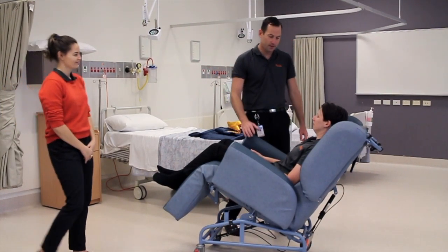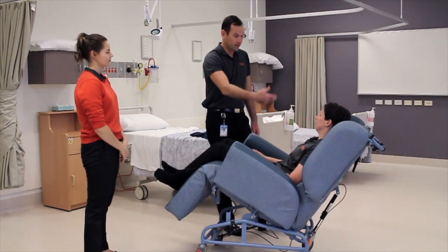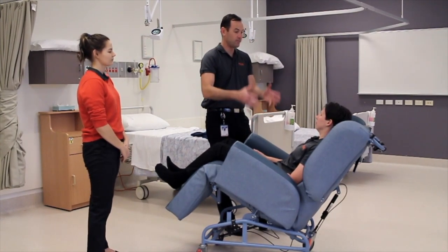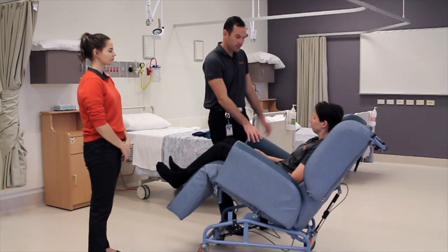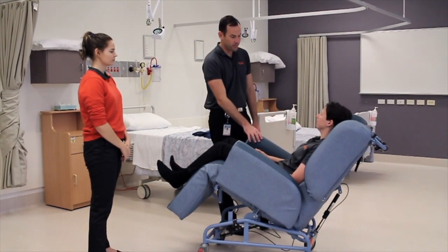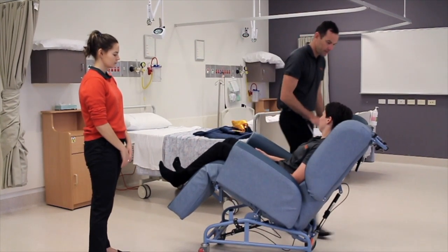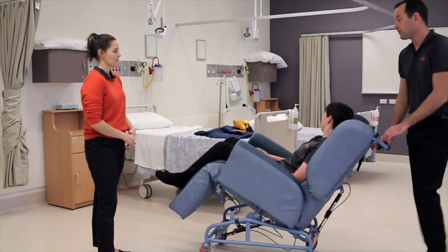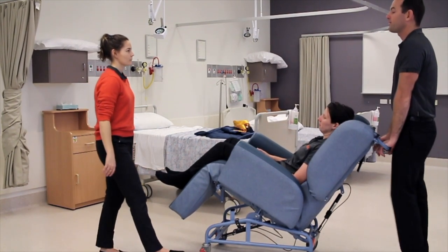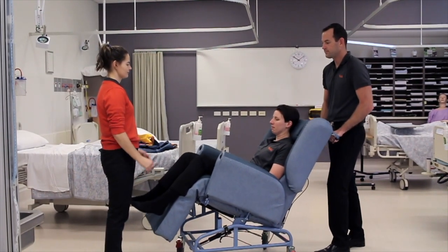We're going to demonstrate transferring a consumer or patient from the flotation chair to a bed using a yoke frame full sling hoist. First, we'll provide cues, prompts and ask the consumer or resident for permission to complete the transfer and grab our second assistant. Also make sure the brakes are locked on the piece of equipment and where possible we'll use our equipment to do the majority of the work.